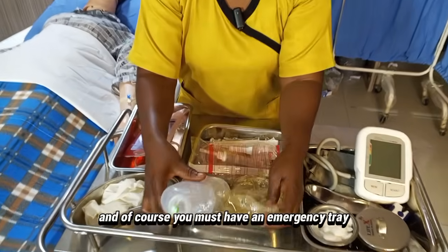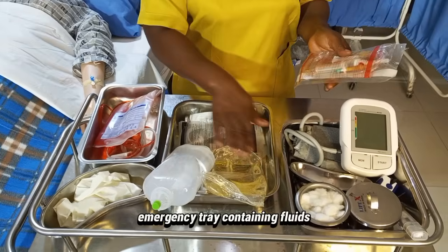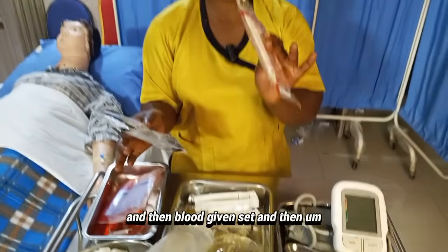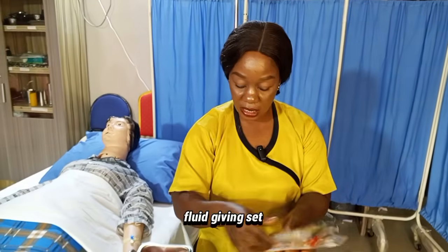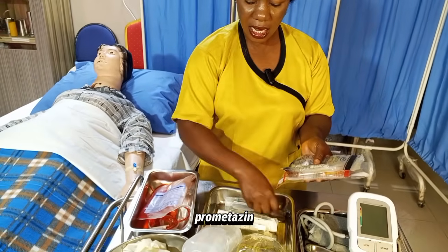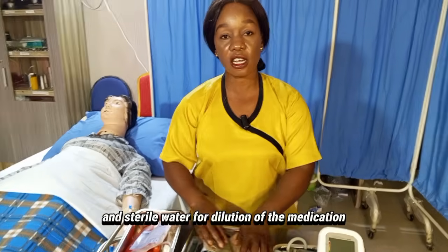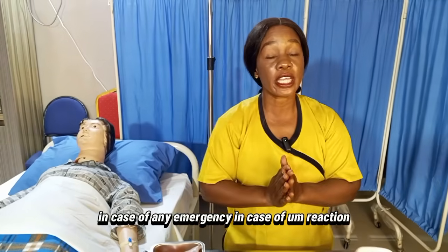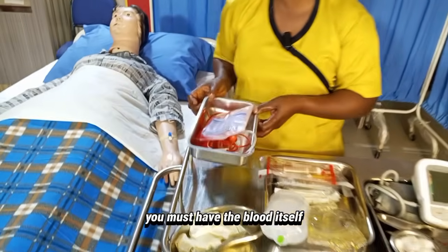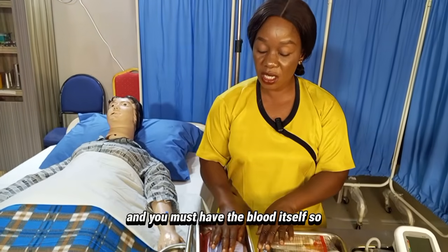You must also have an emergency tray containing fluids, normal saline, blood giving sets, and fluid giving sets. You must have syringe and needle, hydrocortisone, promethazine, and sterile water for dilution of medication in case of any emergency — in case of blood reaction from the patient. And of course you must have the blood itself.